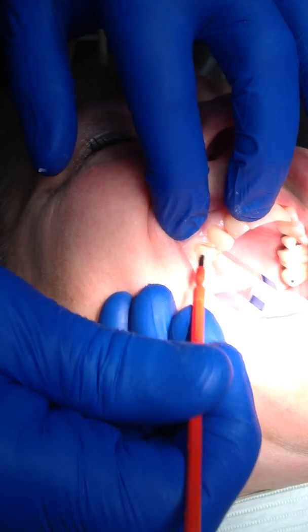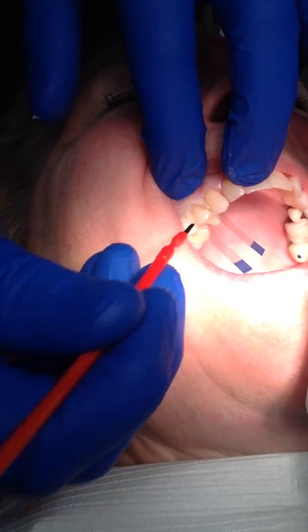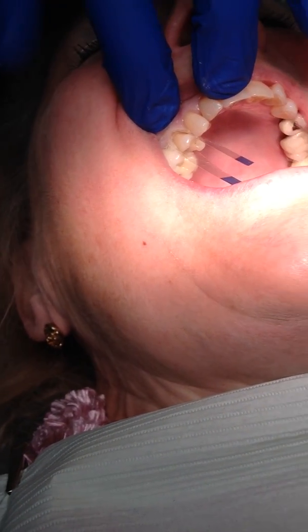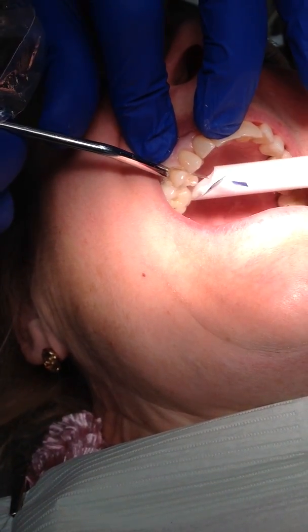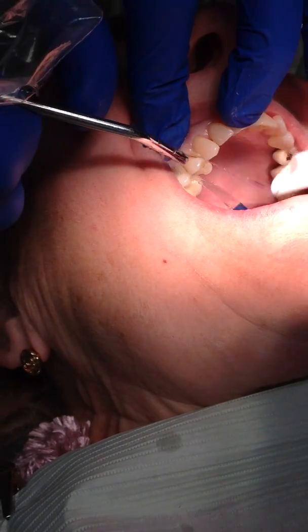Now we've got a band that's very tightly adapted, sitting down between her gums and her tooth, and we can do a very nice job of isolating this area. We do a selective etch — we're etching the enamel. I'm using a very thin gel etch with a brush, just on the enamel, not on the dentin. We leave that on for about 20 seconds, then wash it off. And you'll notice we have a very nice etch pattern on our enamel.